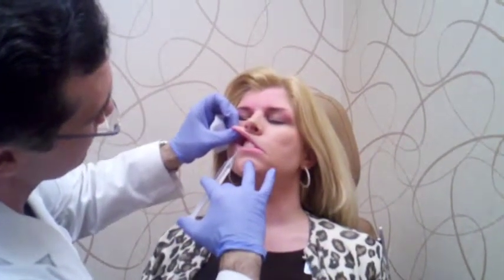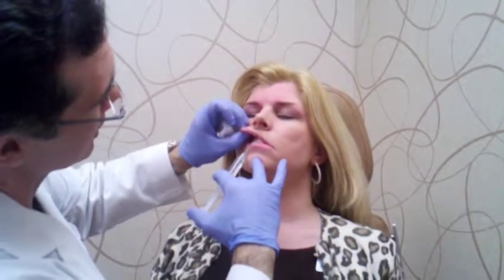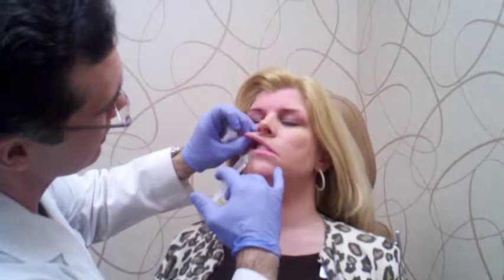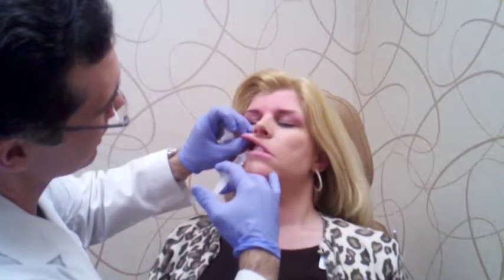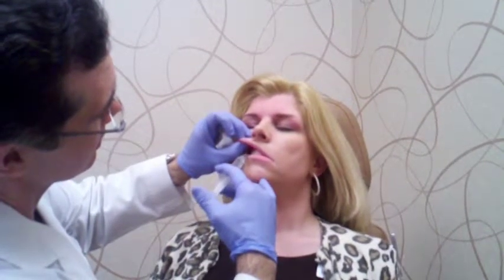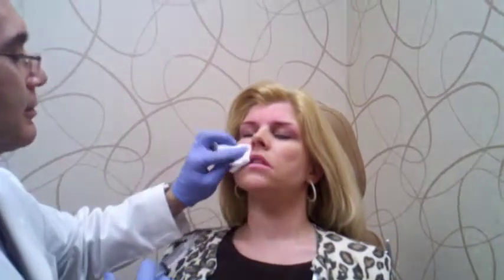A little sharp. You may feel a little pressure now. If I hurt you, let me know and I can go slower. It should be essentially painless. Okay, that's one. I'm going to do the same thing on the other side now.